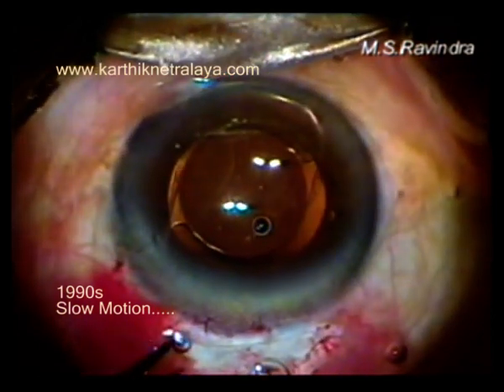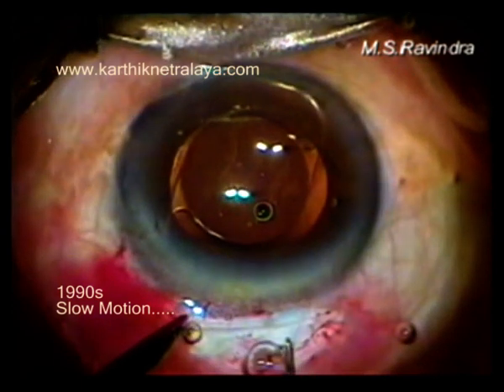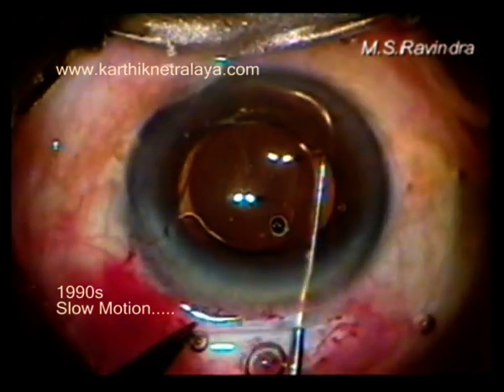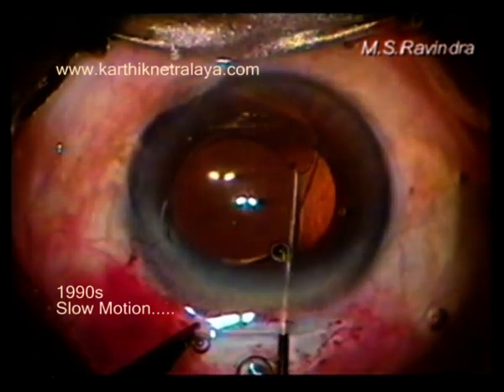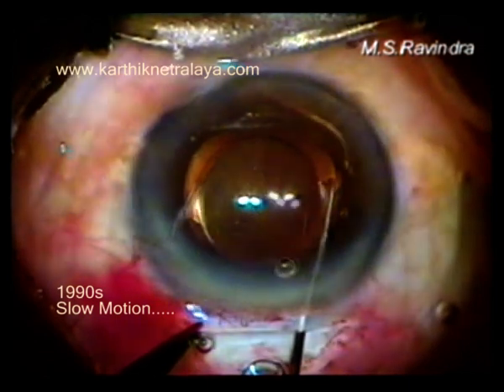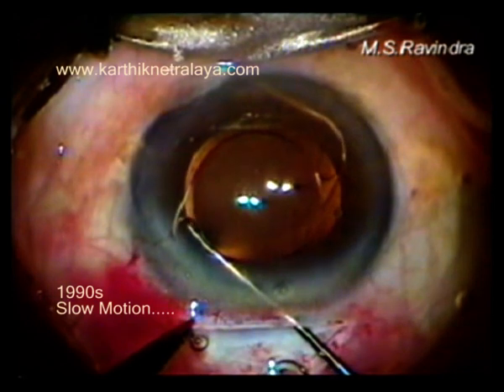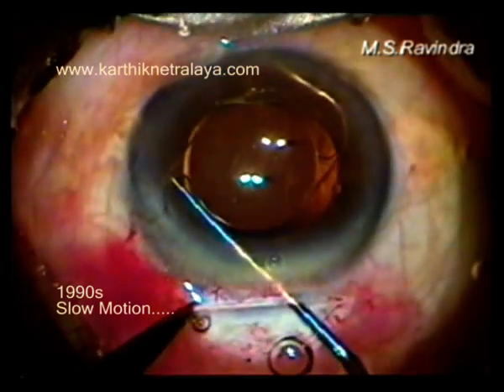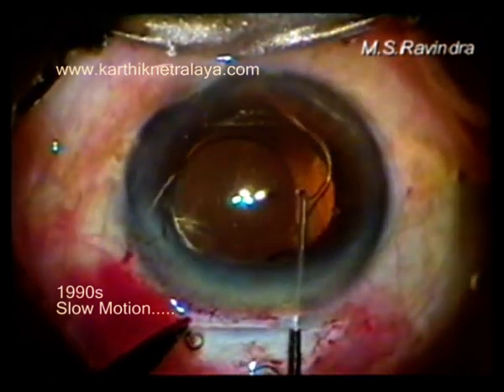It is placed horizontally at the end of the surgery. Withdraw it from the angle with the dialer step by step — I used to call it 'walk on the angle' — so there is no rubbing of the angle with the haptics, using an alternative pull and push, pull and release technique.